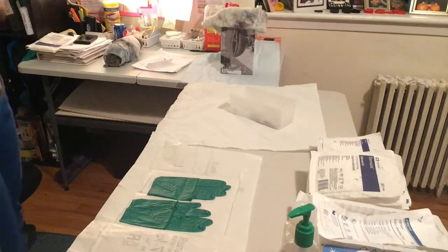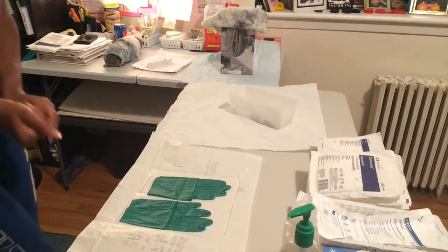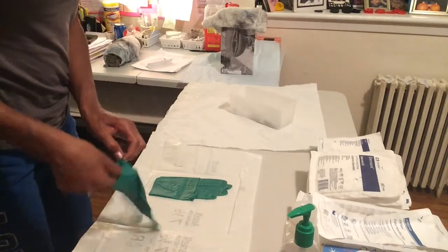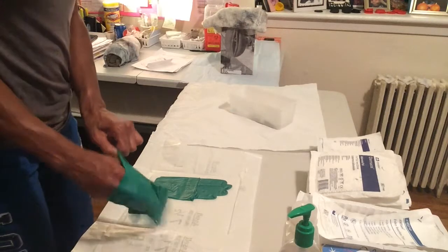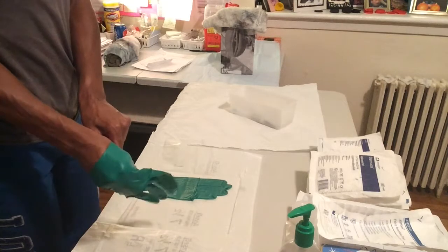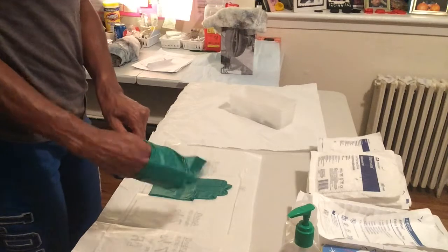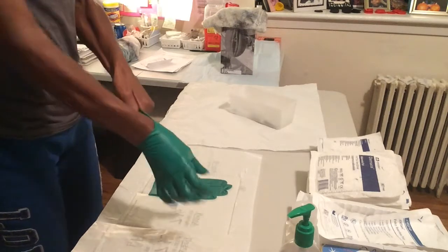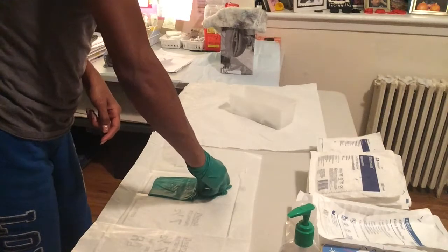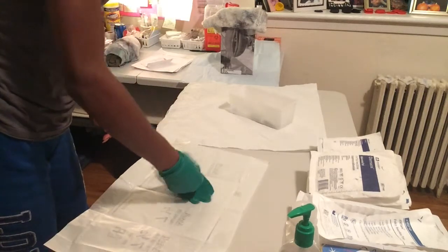Now I'm gelling again and being careful not to reach over the sterile field. Now I'm putting on the sterile gloves. It's okay to touch the cuff with both hands, but you don't want to touch the outer cuff with your donned glove — you want to go underneath the cuff with the donned glove. Sterile to sterile; that outside cuff is not sterile.